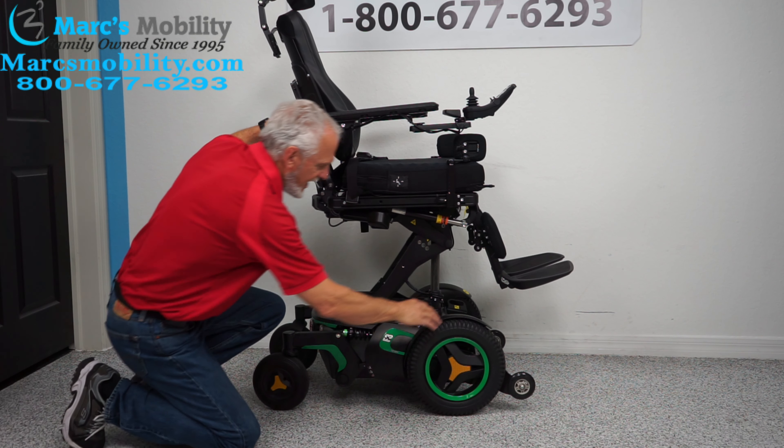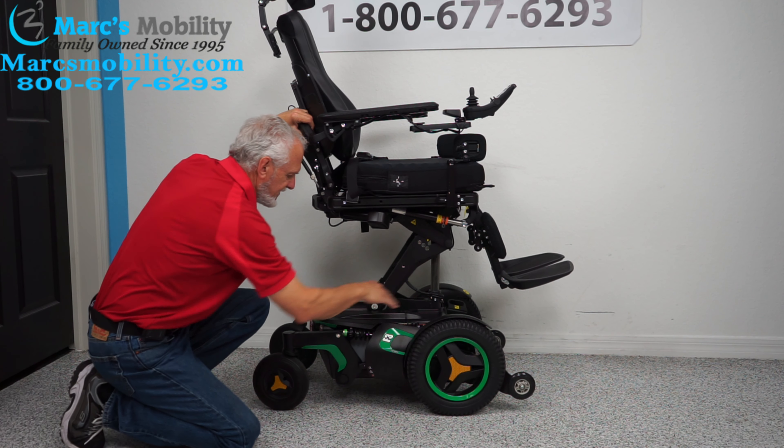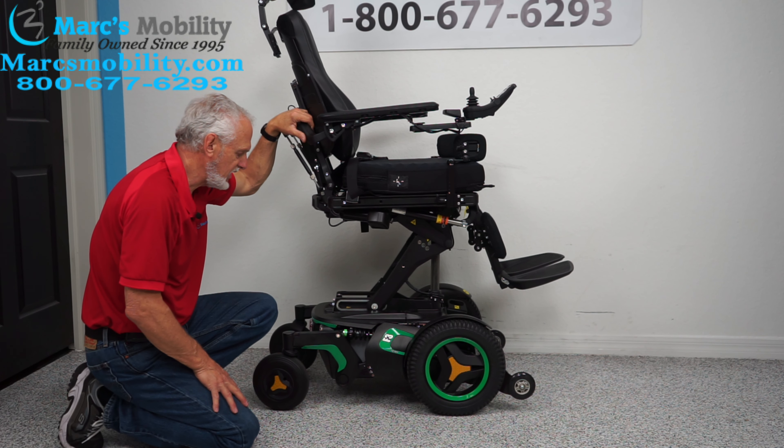You also have an anchor point here and another anchor point inside here — two on this side, two on the opposite side. This is where you secure your chair if you're going to transport it in your van or on your lift.